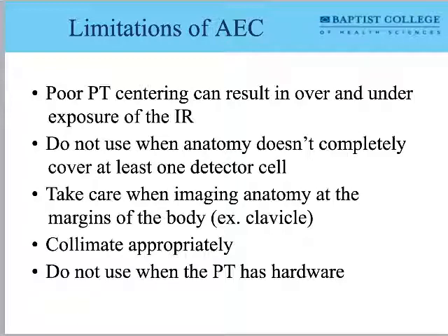So if you don't use an AEC, what do you use? You have to set your own technique. You've got to go back to technique charts. Yep, you've got to go to manual technique. Now you'll find there are some facilities, there was one facility I worked at where for whatever reason the AEC worked great on AP lumbar spines, but it was poor on the lateral, right? So we always had to set manual techniques on the lateral. What we would do is watch what the AEC did on the AP, and we would set the lateral technique based on the AP, right? So you can kind of frog hop off of one technique to the next.